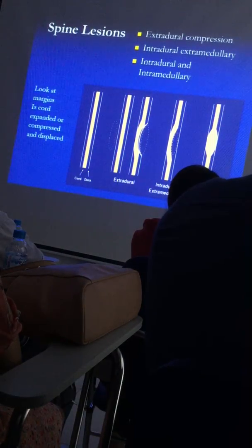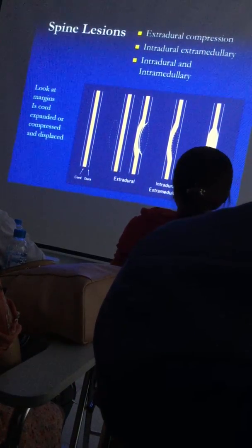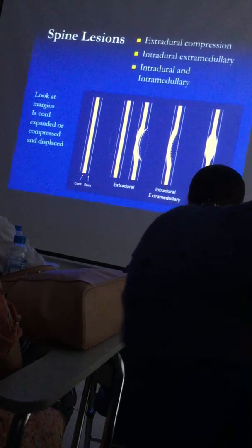Okay, so let's have a talk about spine tumours. So, like in all imaging, we have to decide where the lesion is before we can decide what the lesion is.